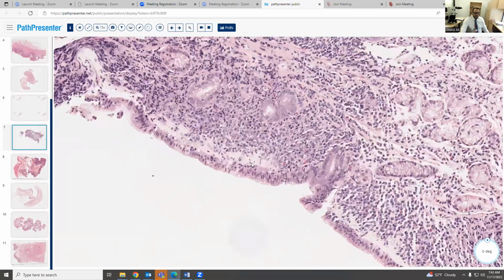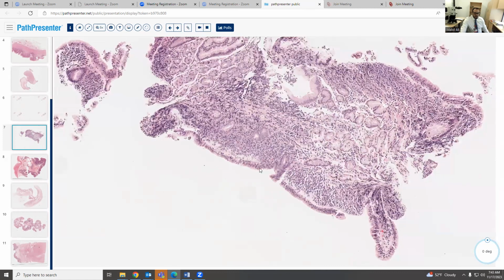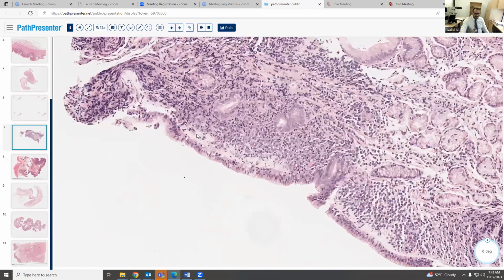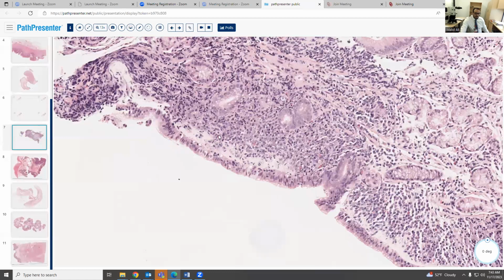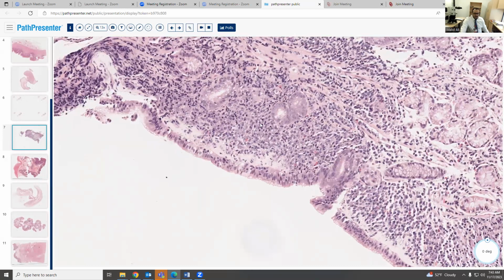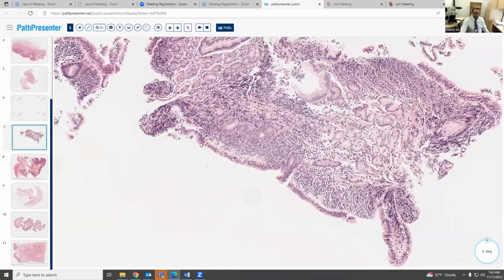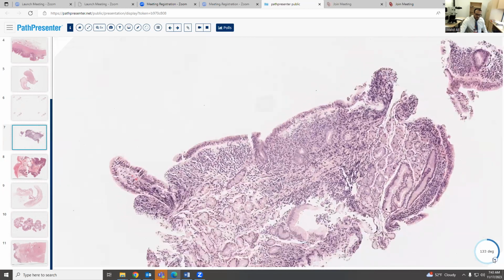And when we look here, there's some subepithelial collagen density here. Even if we do trichrome, it highlights this subepithelial density, and you can see some inflammatory cells. You can see the collagen even goes down and destroys the glands here also. This is called collagenous gastritis. It's the same one that happens in the colon. In the colon, we call this collagenous colitis. And it can happen everywhere, and usually it's common in the colon.